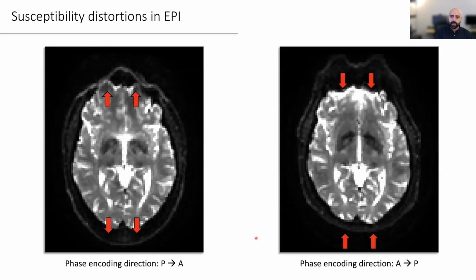Now, I'm going to show you an example that's sort of a cartoonish illustration of how this process works, just so we could understand a bit more how this works out in EPI. But just bear in mind that this is just for illustration purposes. It's not exactly how things work. We acquire data in the scanner in something called k-space, and that's what's being traversed by the sequence.